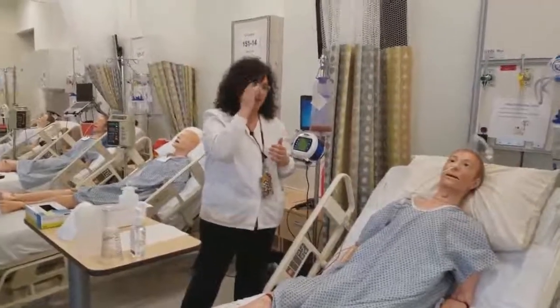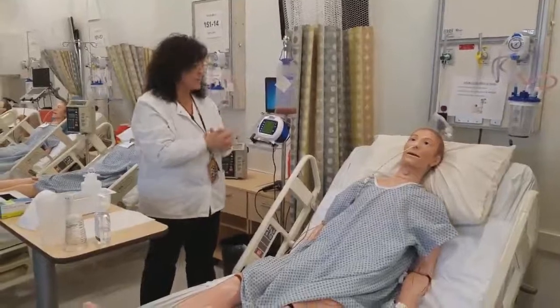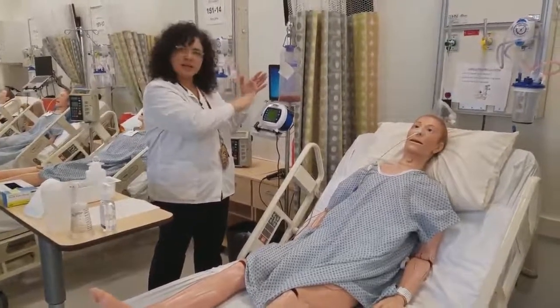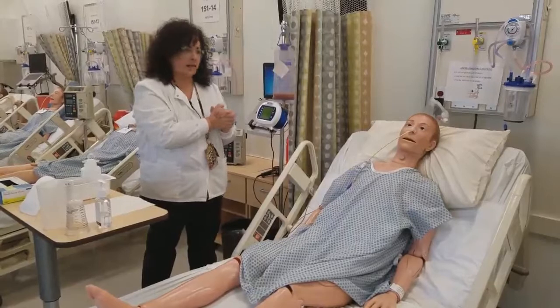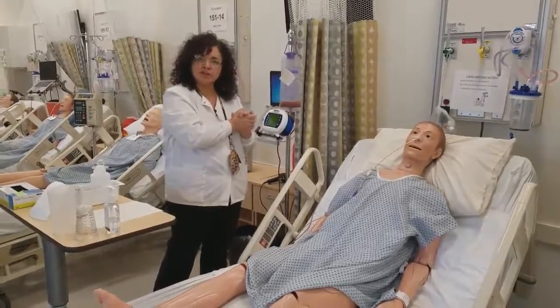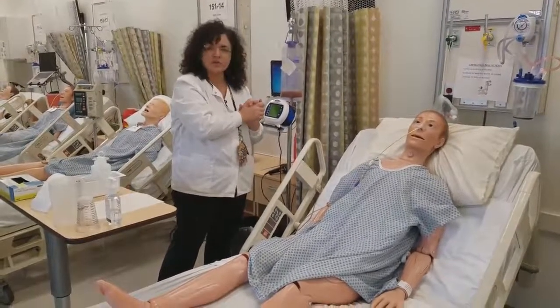So I do have the opportunity to check gastric residual volume, GRV, because the tube is in the stomach. We'll presume that he's in the midst of having his tube feeding titrated up. It was just started last night when he had KUB confirmation of his tube placement, and so we're still titrating up and trying to get to our goal of 70 milliliters per hour.